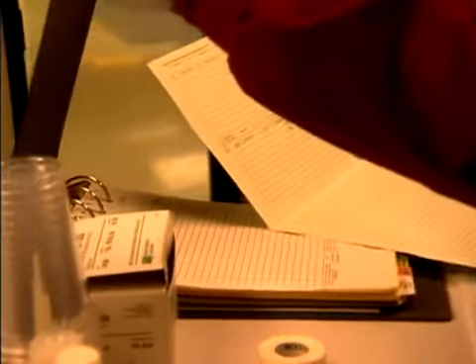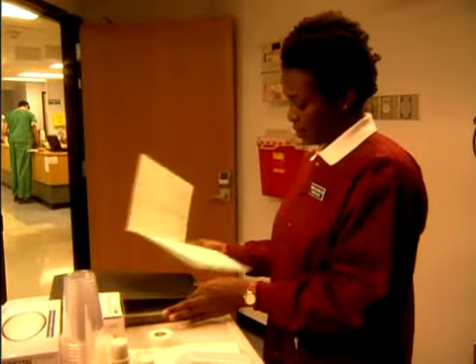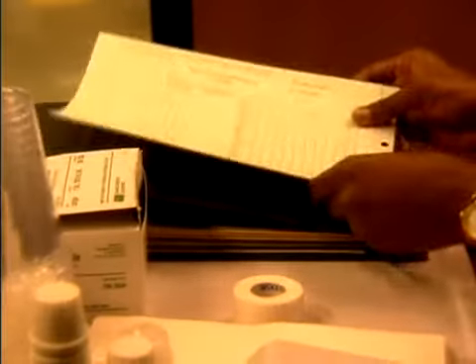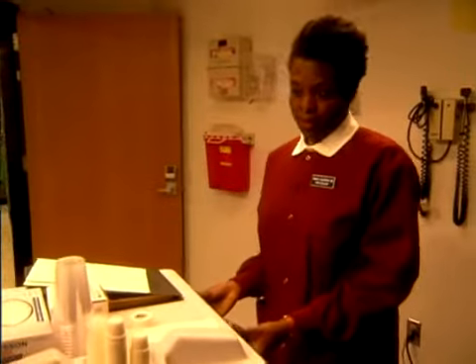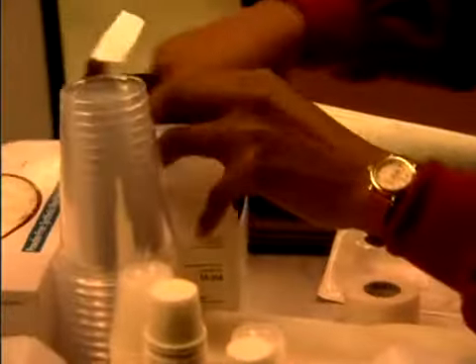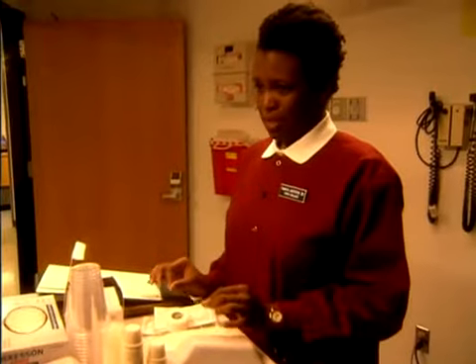First, I check the medication order against the original order. Check for allergies and any inconsistencies. Observing the 3 checks and 5 rights. Then gather my equipment. The MAR, the mini pump infusion tubing, alcohol swabs, and tape. The syringe pump is in his room, right?